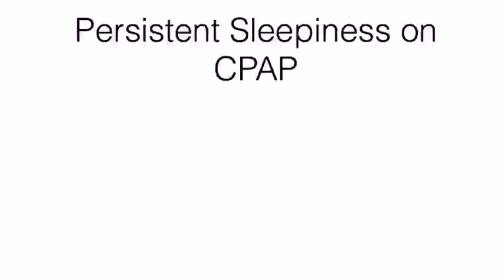Persistent sleepiness on CPAP. Let's consider a scenario. Patient has been on CPAP for the last 30 days following a home sleep study, and the patient returns complaining of persistent daytime sleepiness despite their claim that they're using the CPAP machine daily. Now, the first thing you want to do is get the download data.